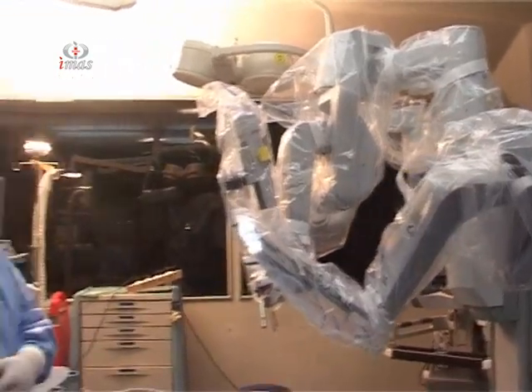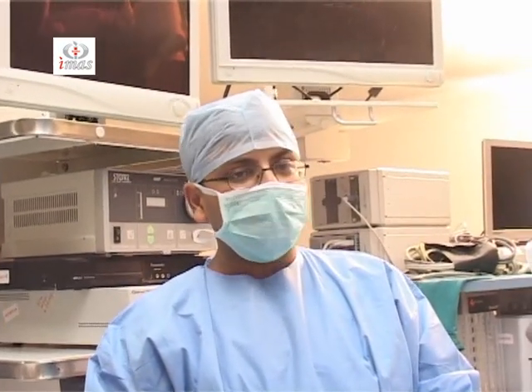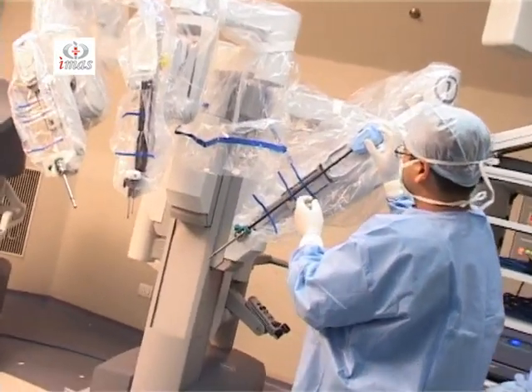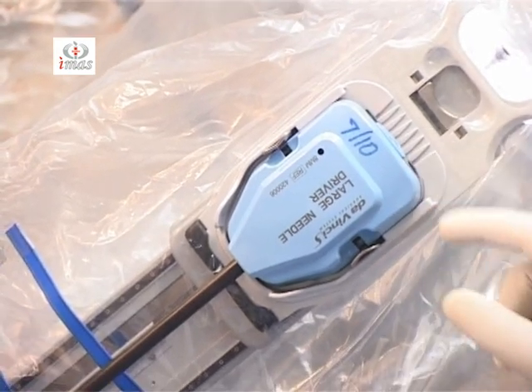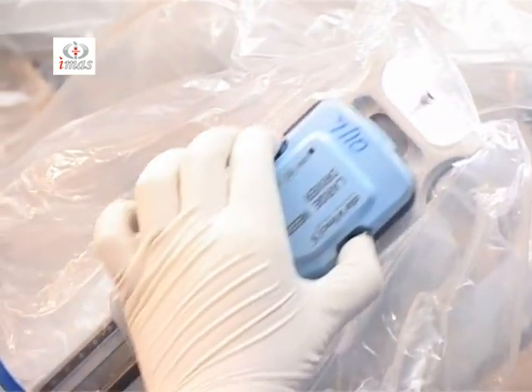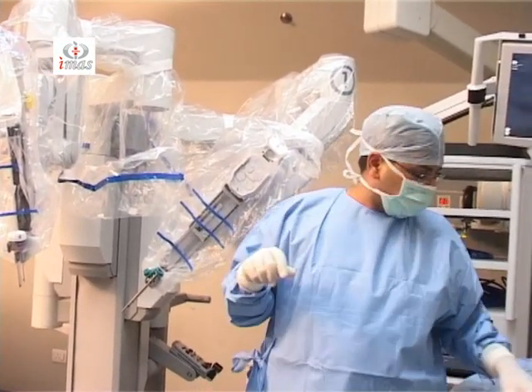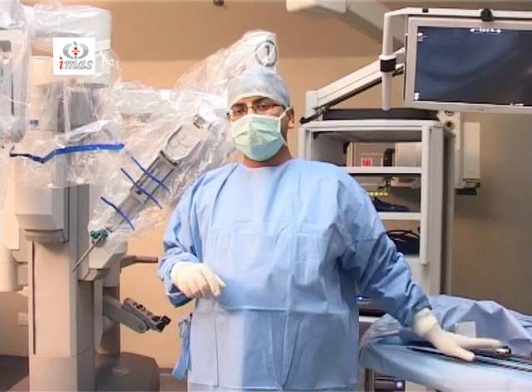So in case there is any inadvertent bleeding, or if you want to convert it directly to a laparoscopic or open surgery, you can just undock it within a matter of seconds. So these are the endo-wristed instruments which are inserted onto the robotic arms like this, and then they are identified by the robotic arms. They can be just released by pressing the release levers, and they can be taken out and they can be placed there. These instruments are 10 uses per instrument, and after 10 uses the instruments cannot be used for any further use.